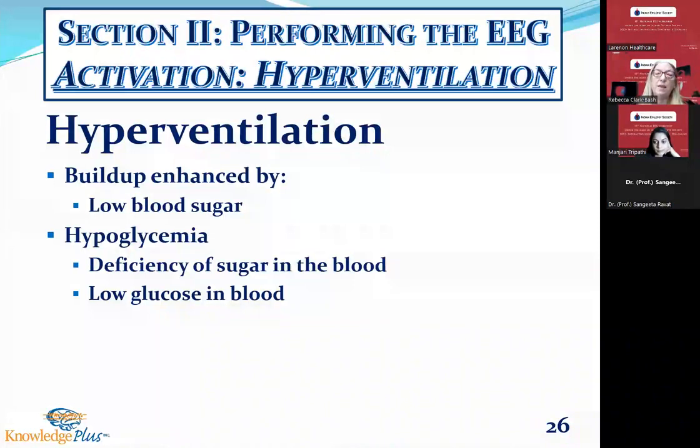Now, patients who have hypoglycemia, low blood sugar, can have a prolonged buildup response past that minute. So when we start the EEG in our history, we should be writing down the time of the last meal. And what I find is most of our patients, they're not just having an EEG. They're having multiple tests. They're having a workup.